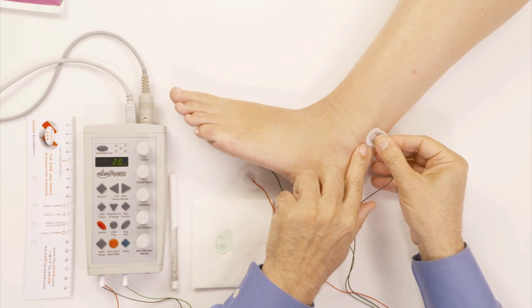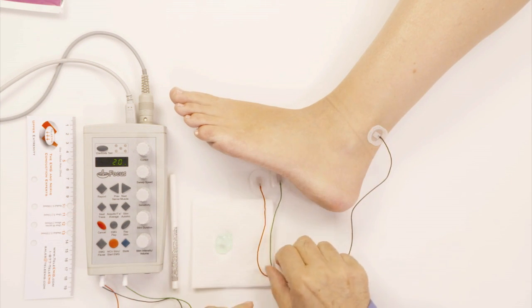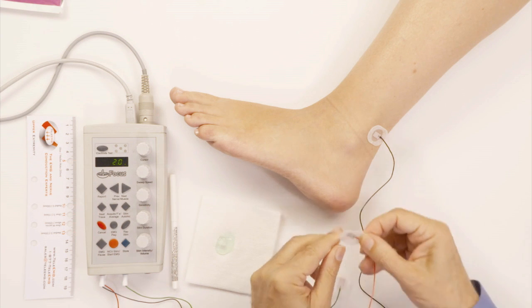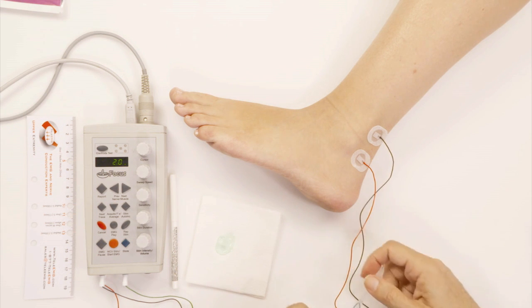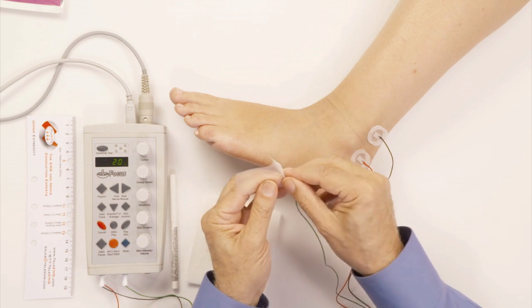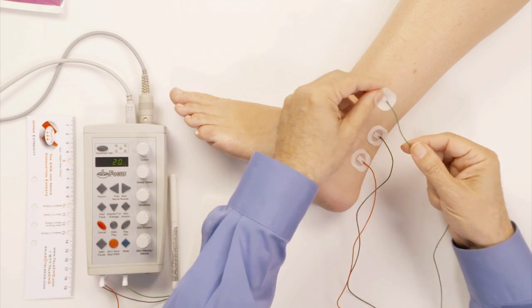The black electrode is going to be placed right behind the ankle where the sural nerve is, and the red reference electrode goes right below it. For this particular nerve, I like to put the ground electrode somewhere on the leg — right here.